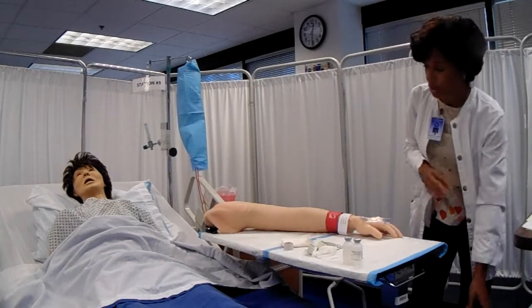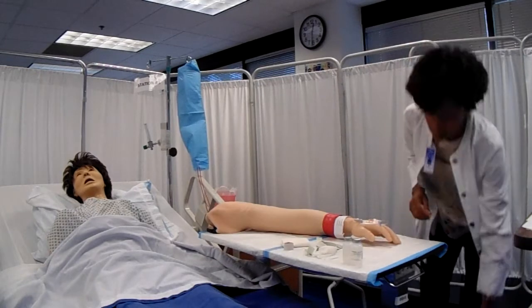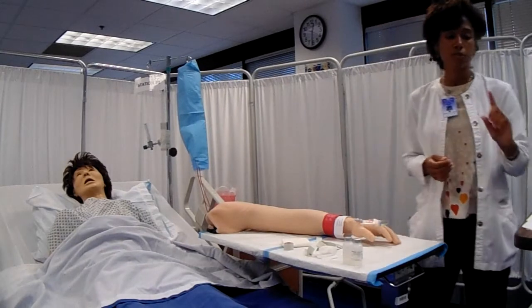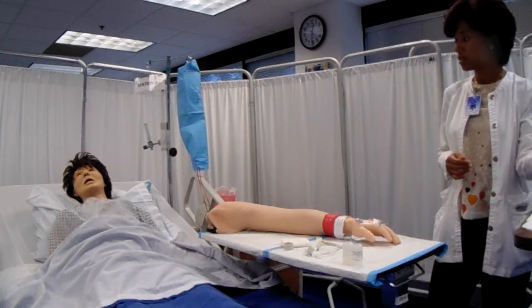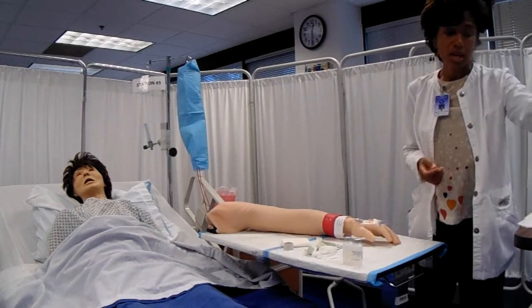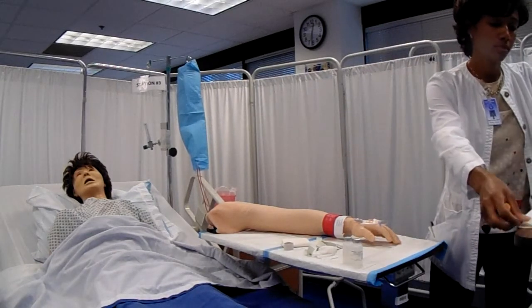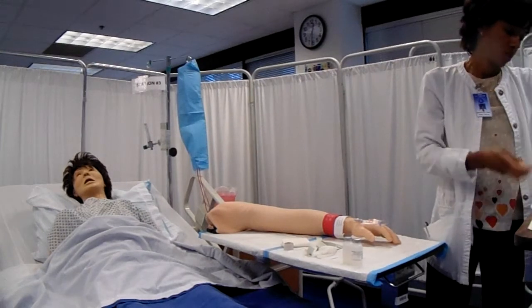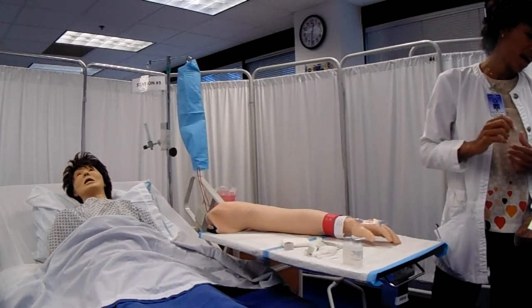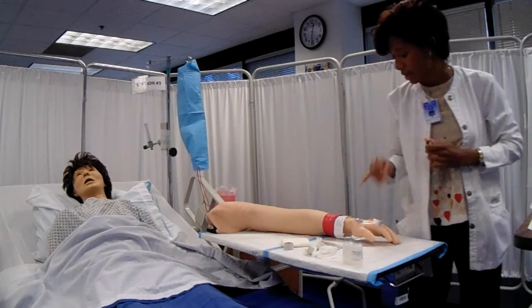So now I'm going to move to the second part of our planned procedure today, which is medication administration. I've already verified your name and date of birth and your allergies. I also checked the MAR against the doctor's order. And now I'm just going to go ahead and verify the medication against the MAR, against your name and date of birth. Okay, I have here 20 milligrams of furosemide to be given intravenously stat to Miss Miley Cyrus, date of birth April 1st, 1990. That's all verified.